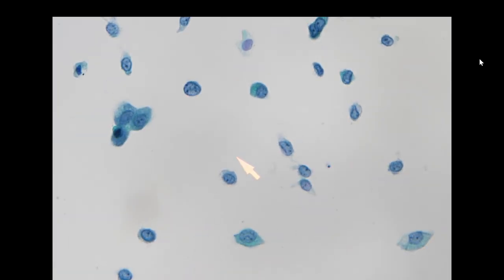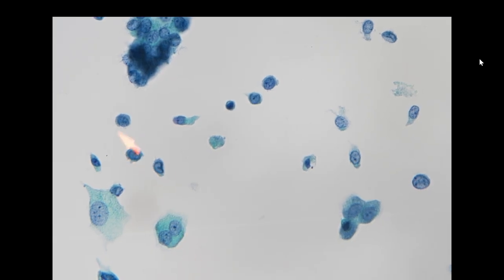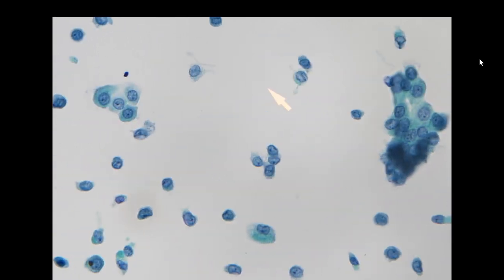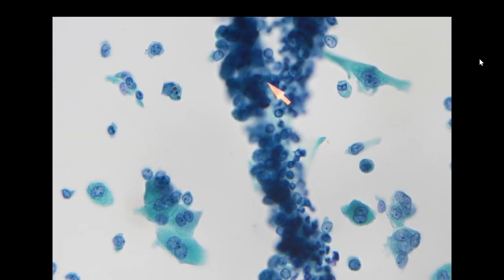Additionally, we do not see striking hyperchromasia. But overall, these cells have a very monotonous appearance. So here we have a benign intermediate and umbrella cell. But in the background, we have a lot of these smaller cells with a little bit higher NC ratio and a very monotonous appearance. And these cells seem to be detaching from this papillary structure.